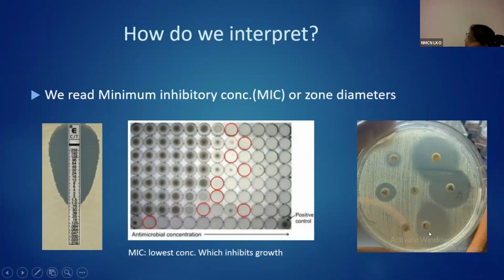See, this is a plate where this is a disc of erythromycin, right? And this is a disc of clindamycin. I'm saying in case of Staphylococcus aureus or Staphylococcus species. As you can see, around the clindamycin there was a zone of inhibition, which has now been suppressed due to erythromycin. You see on the side of erythromycin, the zone has been decreased.